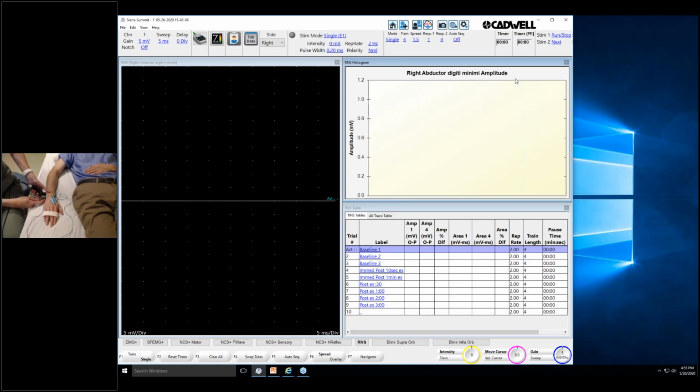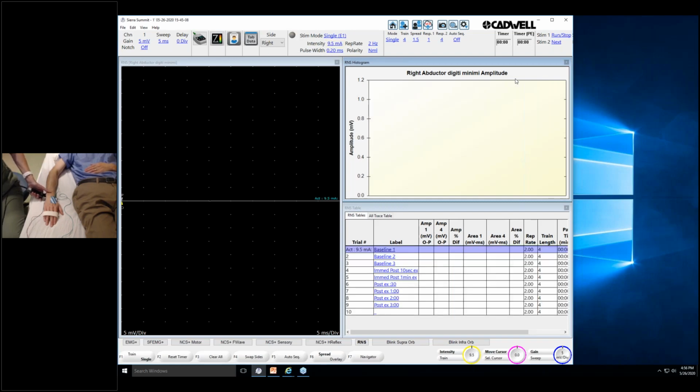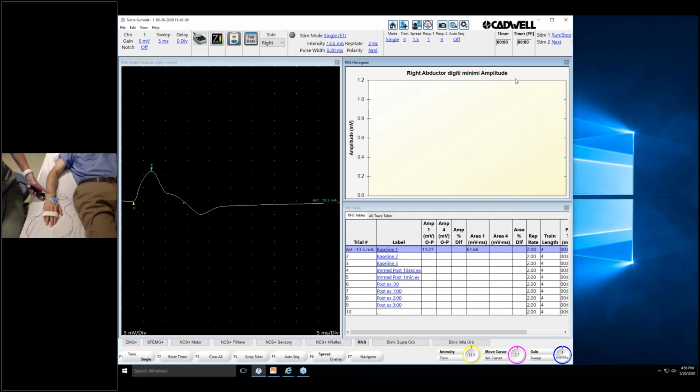All right, so I'm going to go ahead and bring in the ulnar. You feel anything? Now I am. Jennifer's sliding around trying to be nice to me so she doesn't overstimulate. And just to make this demonstration harder, my ulnar nerve lies right underneath my FCU tendon, which makes it technically a bit more difficult when you're doing rep stim. Remember, anything that moves the stimulator away from the nerve is going to change your amplitude. That's true. I've found that I'm right underneath the tendon right now.